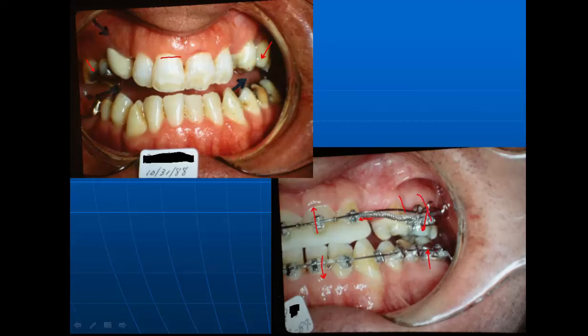Of course, the arch wire actually helped push these down, because you're pushing up over here on this part, and you've got to be pushing down with the same amount of force back here. So the arch wire helped bring them in, so it looks like there's nothing here to make it come in like that, but this is actually fact.